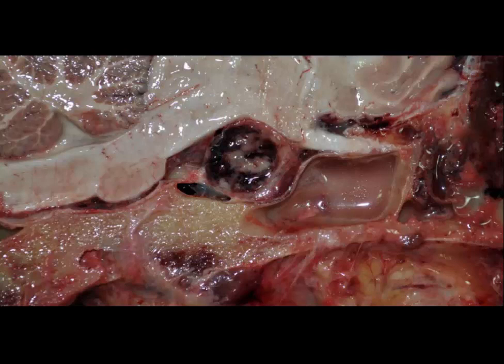Okay, your time is up. Hopefully you've been pausing this. I want to give you more than 5 seconds per. And we are looking at the hypothalamus, and compressing and elevating the hypothalamus, there is a well-circumscribed, somewhat darkly pigmented or hemorrhagic mass, and this is very characteristic for horses.